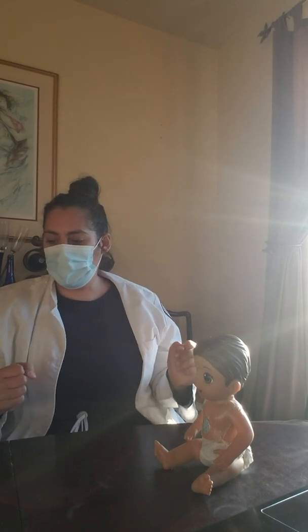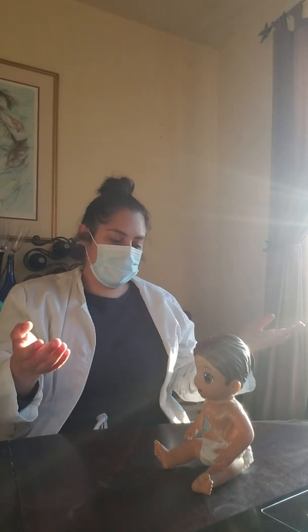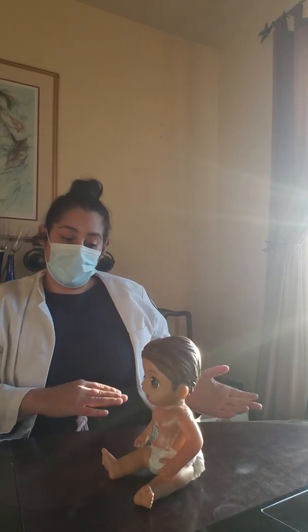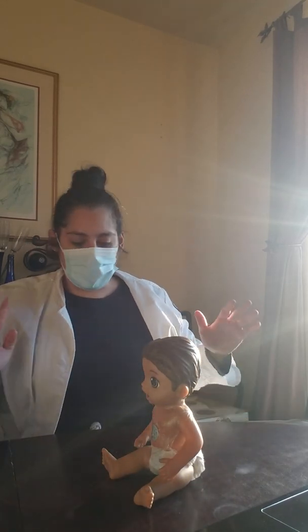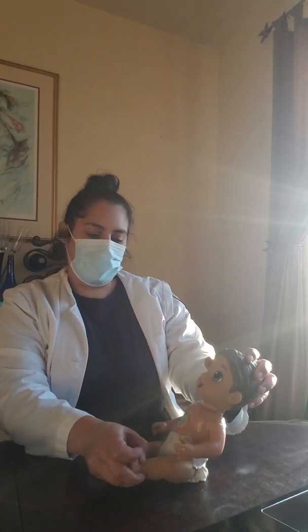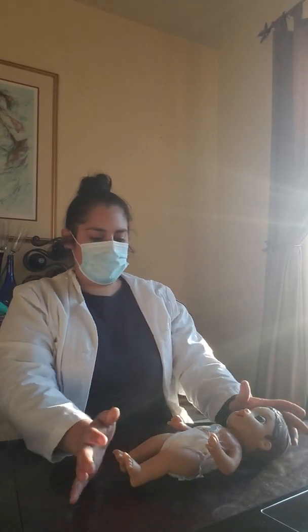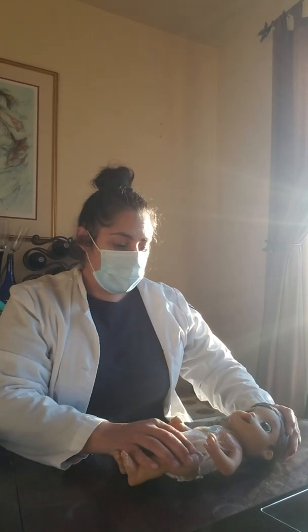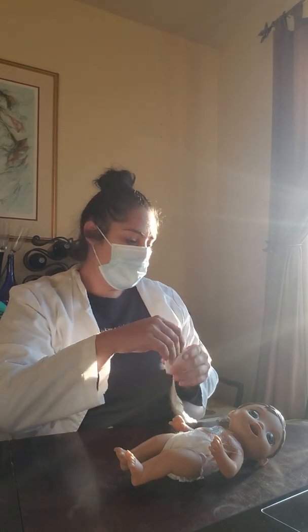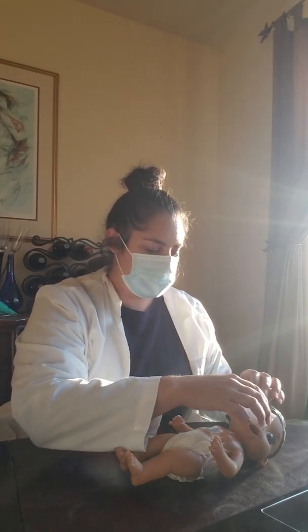So, I am going to get started by setting you up, raising the bed to a comfortable height. And I'm going to go ahead and put you in a laying position. Just let me know if you're not able to tolerate this, okay? All right. So I will lay the patient down to a supine position. Can you please look away that way? And I'm going to ask you to put a mask on just for some extra protection, okay?